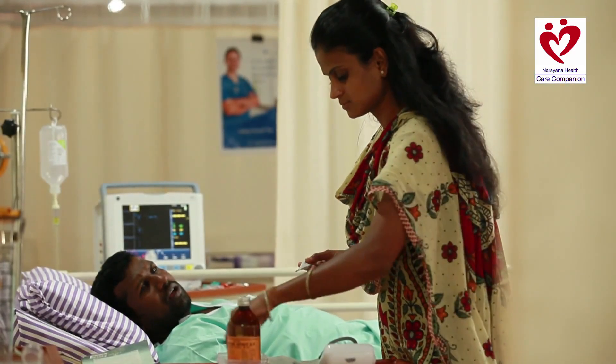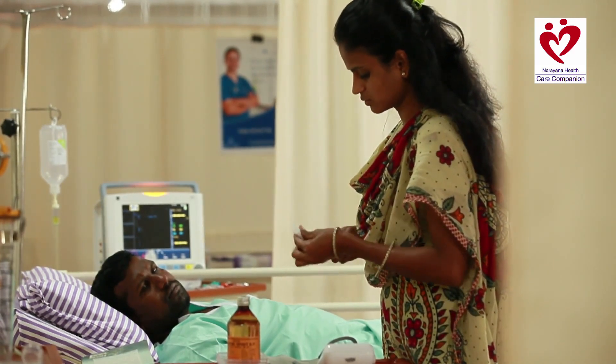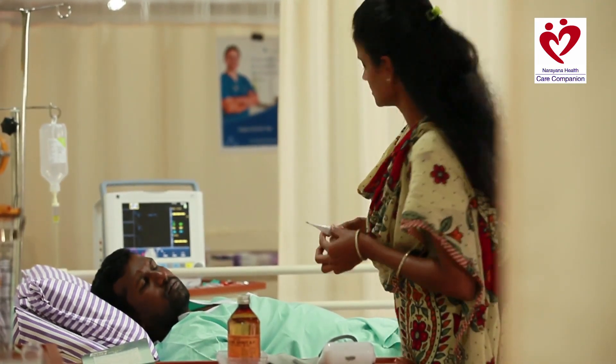You checked the temperature, right? Yes, but I have to check thrice — once in the morning, once in the afternoon, and then in the night. Have you washed the thermometer? Yes, I have washed it.